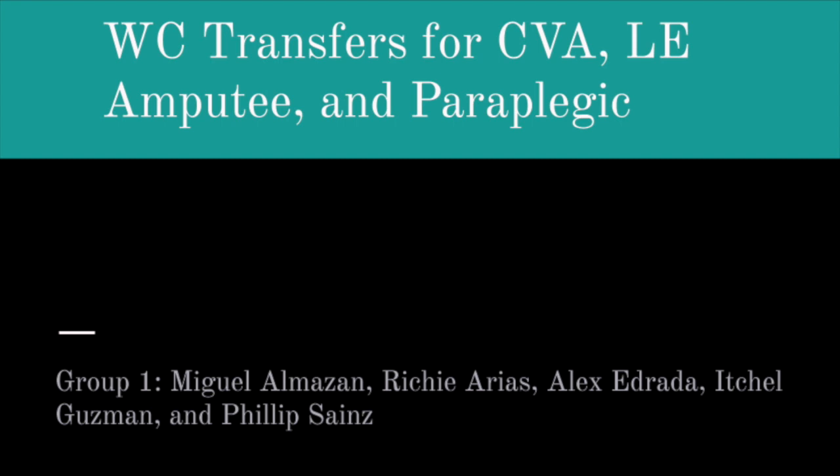We are group number one, and we will be presenting information on wheelchair transfers for various diagnoses, as well as showing some demonstration videos of each transfer. Also, just a side note, due to the current circumstances we are all experiencing with staying isolated at home, and for the safety of everyone, some group members were unable to film demonstration videos outside their house or have access to appropriate DME. We will start with Miguel presenting on wheelchair transfers for CVA.